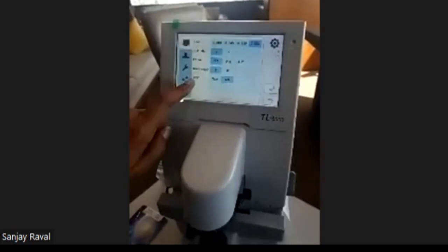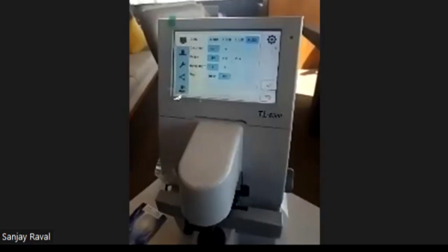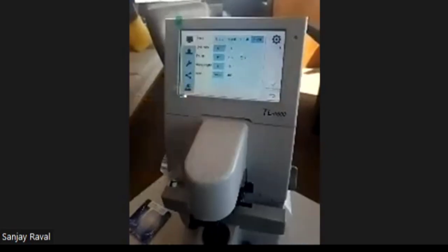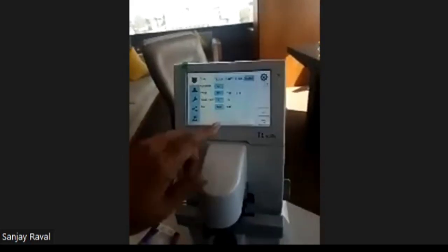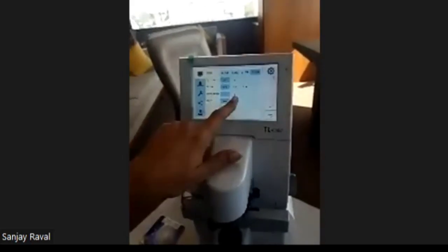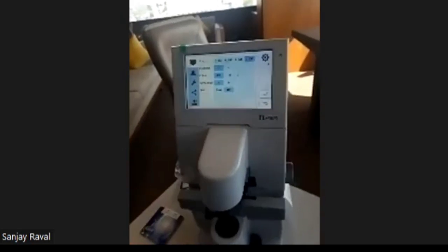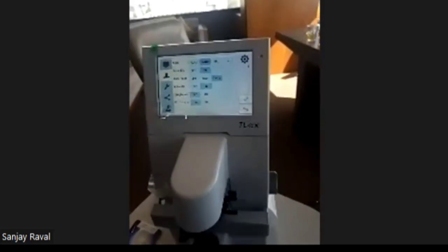And for the near measurement, should it give the complete power of near or only the addition? We can select. If you select only near power, it will consider the near vision as an individual lens and it will give the complete power, which is not the case. Normally, we use the addition terminology, right? This is for the measurement part settings mode.